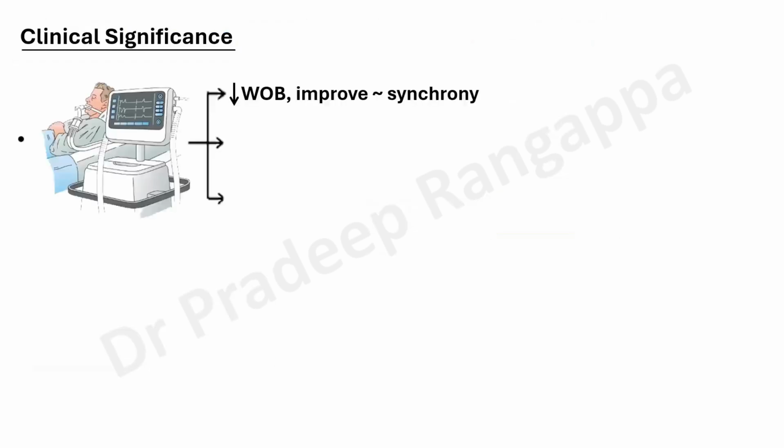So what about the clinical significance? It is claimed to reduce the work of breathing and improve synchrony because of that optimal tidal volume and respiratory rate that the machine sets to achieve that minute ventilation. And it reduces the time for liberation from the ventilator, or the duration of mechanical ventilation.